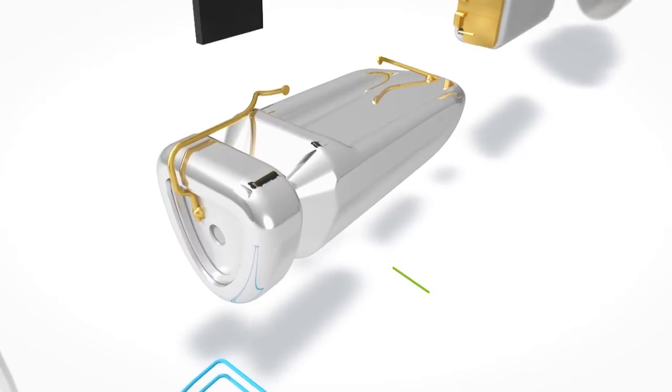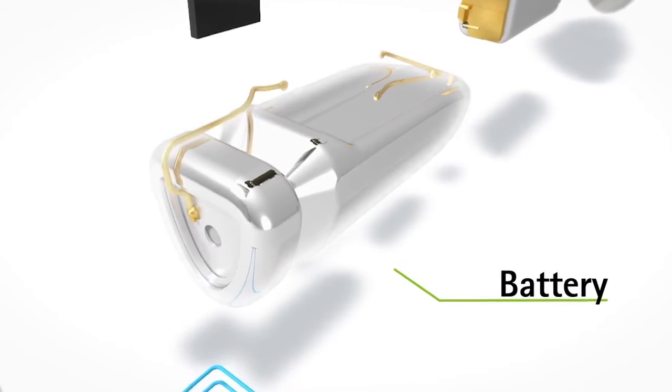The Lyric battery was specifically designed to fit deep in the ear canal and for a very small device size. The battery is produced by Phonak to power the device for an extended period of time and to withstand the harsh conditions in the ear canal.